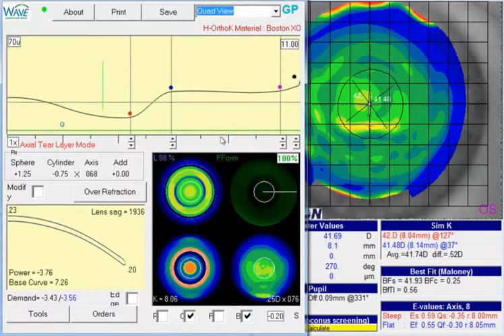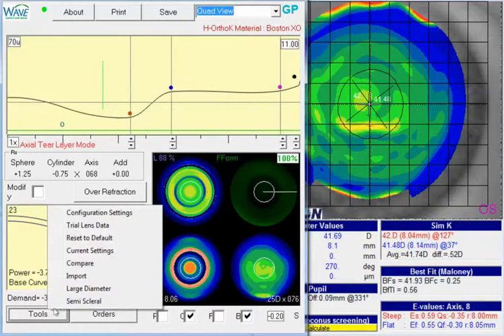If we still need a little bit more correction, then let's consider going to a freeform design at that point. Remember, you can't just click the box, you have to go into your tool configuration settings and kind of redesign this one.